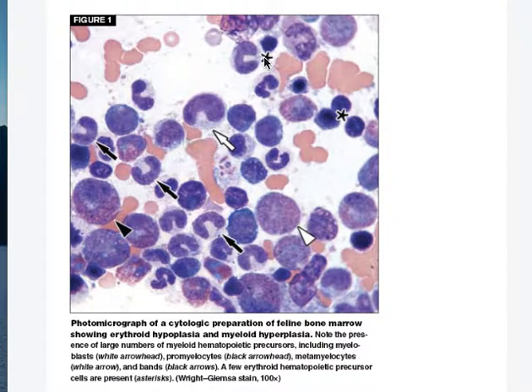So when we're doing this one, we can see that these erythroid cells are all pretty mature. These might be erythroid in here, and maybe this one. This one's a little harder to read than the last one. So we want to go in here. We know that this is going to be myeloid. It's indented, so that makes it easy.